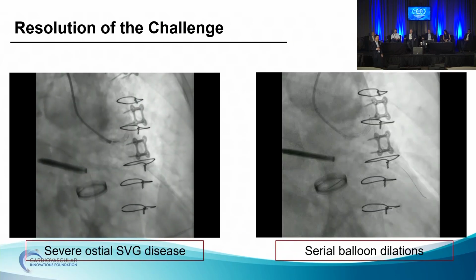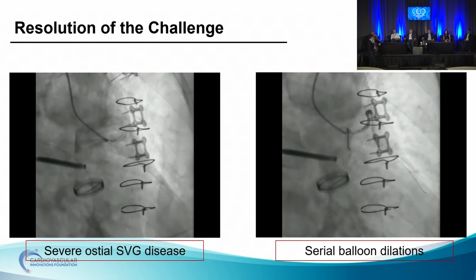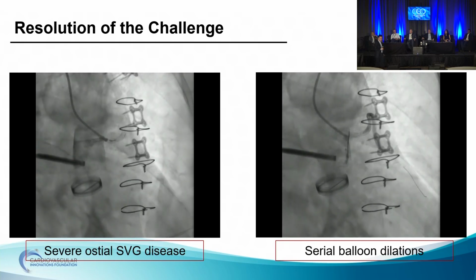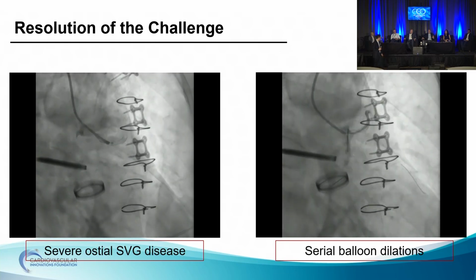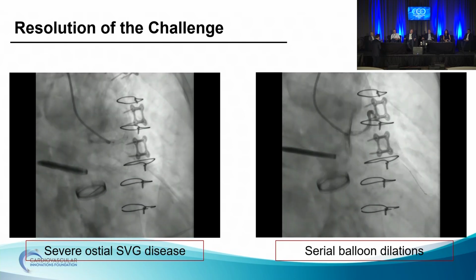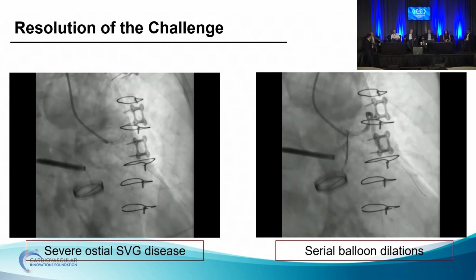And lo and behold, once we engage the vein graft, that's what you're dealing with. So it's pretty much can't get any better than this. So we wired. The natives, you show the natives. There is no native left main, so like they never reimplanted. So SVG is all you get to the anterior wall, and reimplanted right.